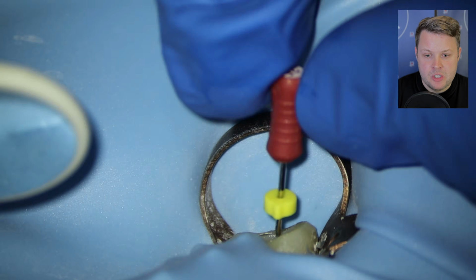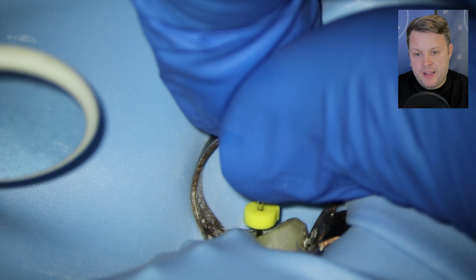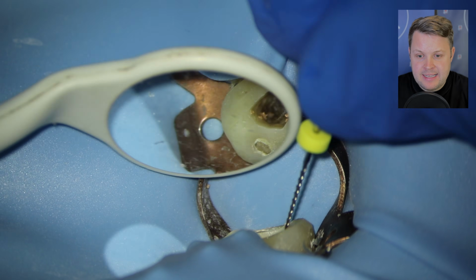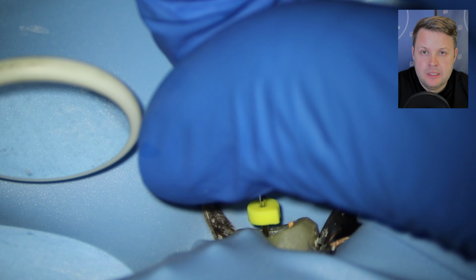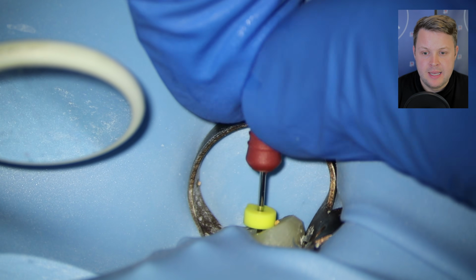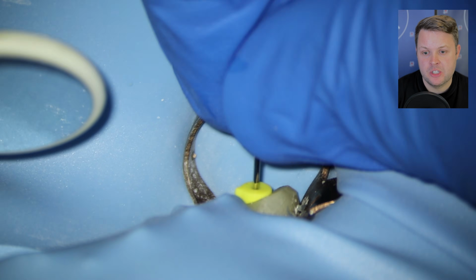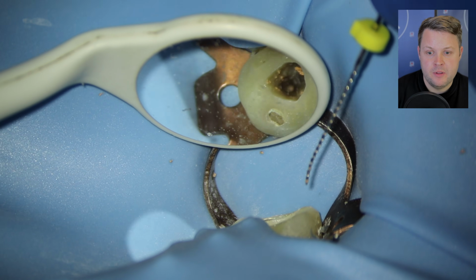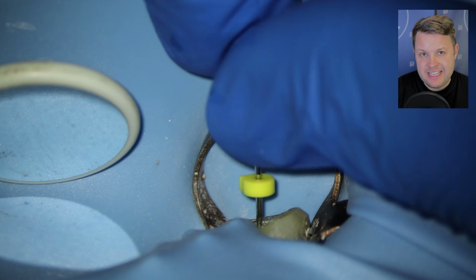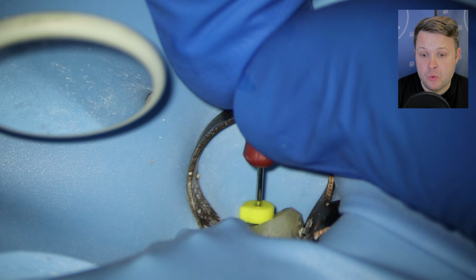And again, I'm just using another succession of size 25 Hedström files just to try and remove this excess GP. And in this case, it's a bit different now when I use these Hedström files, because I've noticed that these Hedström files are screwing into something. So this gives me a little bit of hope that I'm engaging some GP, and this is going to be me pulling it out and possibly negotiating to length.